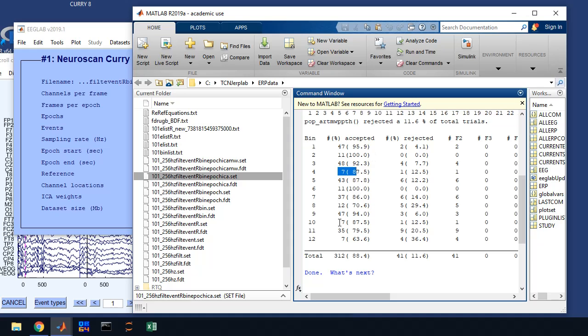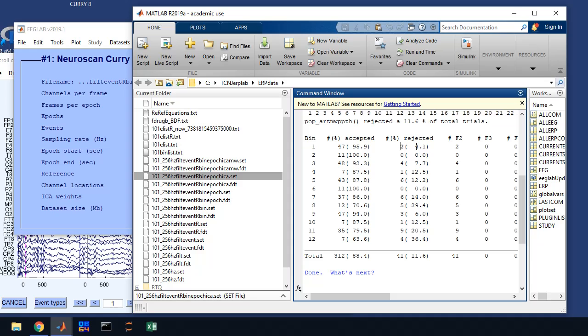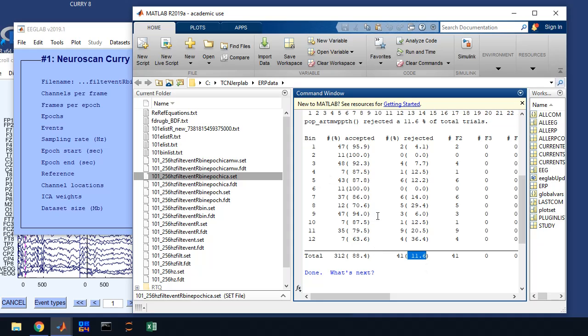But if you look over here on this other column, it tells you the number of trials and then the percent of trials that are rejected from each of the conditions. So when we ran that moving window, it rejected two from this bin, four from this bin, six from this bin, and so on, for a total of 41 trials or 11.6% of the data. That's not great, but it's not terrible either. And the end result is what are the numbers in your bins? Is it good or not good? So pay attention to that as it's going by.